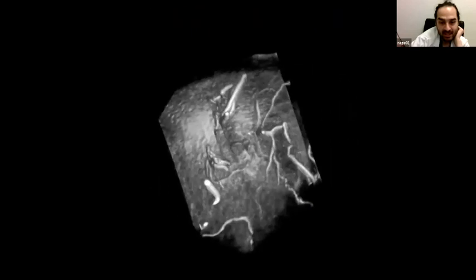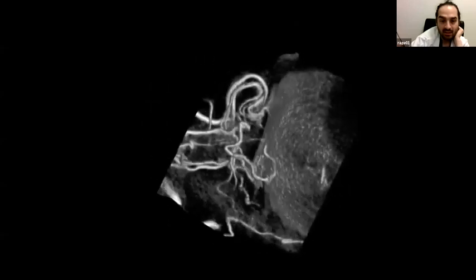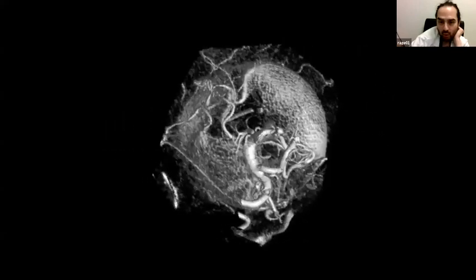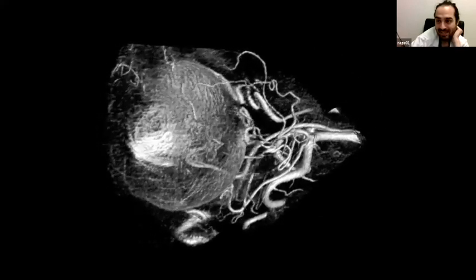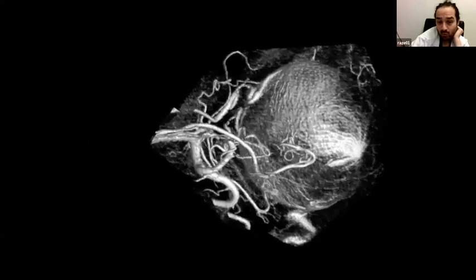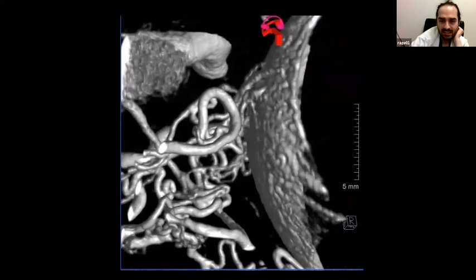again, like other examples of the volume rendering of these vessels that you can then rotate around and look at very closely. There's no higher possible resolution that you can obtain with any other imaging in current medicine of the vessels posterior to the globe. There's no MRA nor CTA that is able to show vessels in this particular way. Just another example of the same.